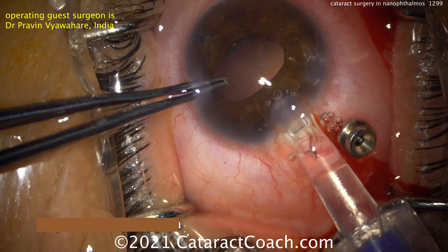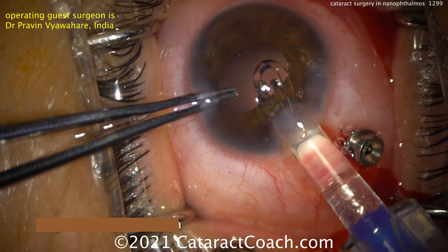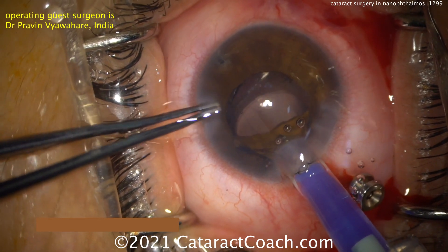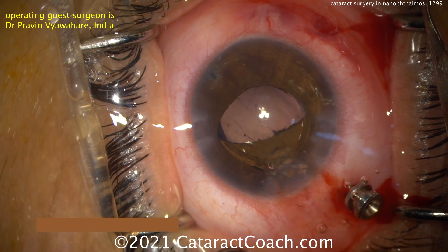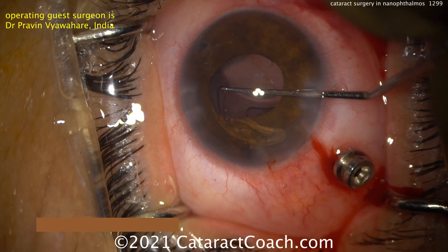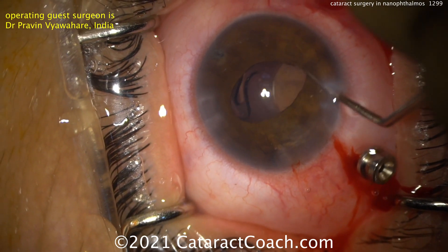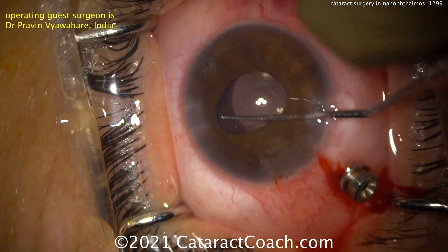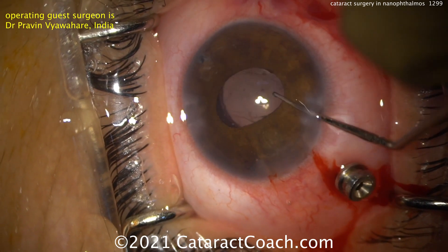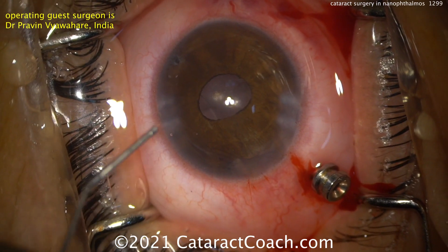Here comes the lens — this is a special order, not available in the U.S.A.: a 63 diopter lens. This power can be all across the board; it's impossible to predict this patient's post-op refractive outcome. The patient can be anywhere from plus to minus — I'd say the chance of hitting plano in this eye is about 10%. Getting that lens dialed into an appropriate position in a stressful case, and that 5–6mm optic looks absolutely humongous in this tiny little eye. I like single-piece acrylic lenses because they are a lot more forgiving — with a tiny capsular bag, both haptics can absorb a little and keep that lens in place. That looks like a nice outcome.